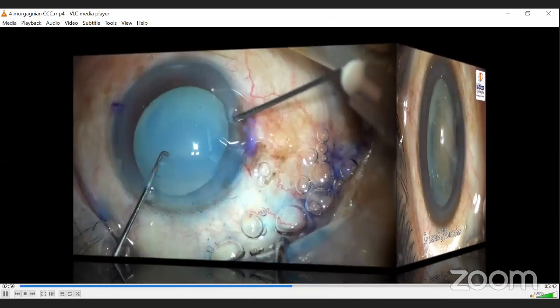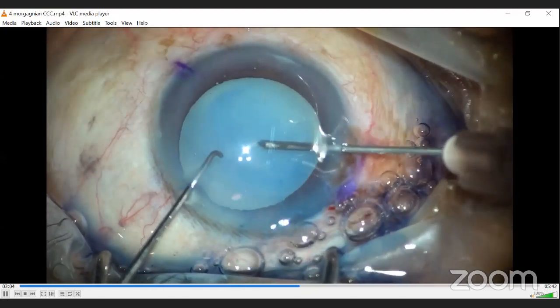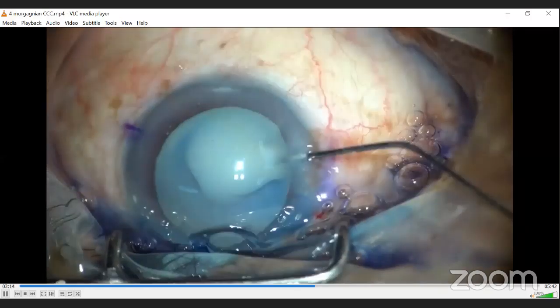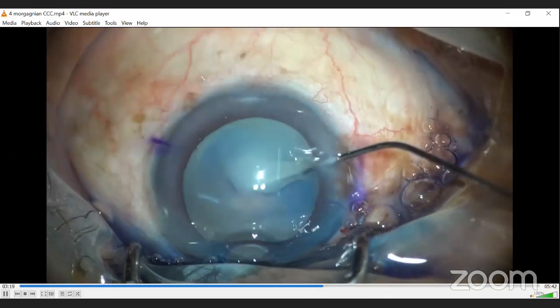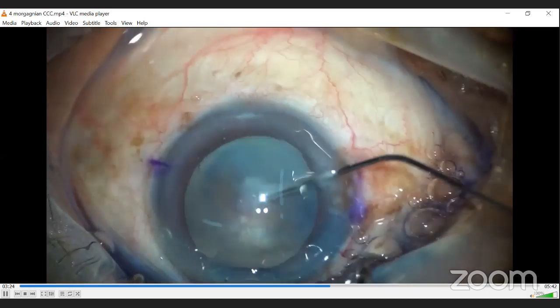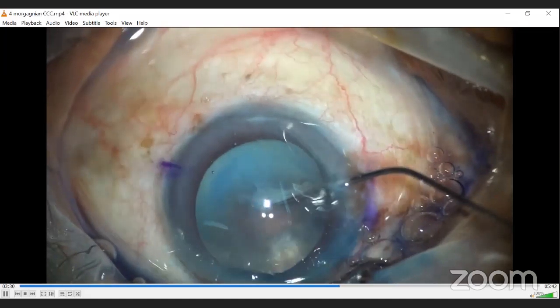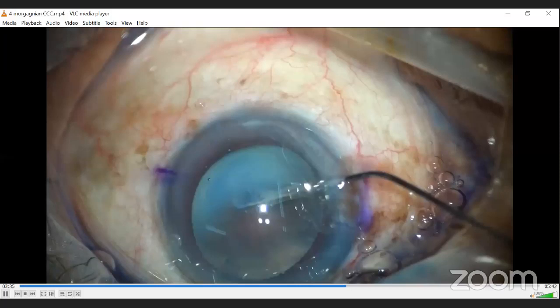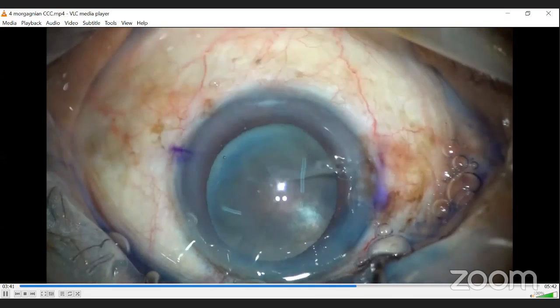Now, this is another case of Morgagnian cataract. Again, here I am going to show why I don't prefer to use cystitome. Because unlike capsulorhexis forceps, to use cystitome, we need good support of the nucleus. That is quite essential. As you can see here also, the cortex is all liquefied there.